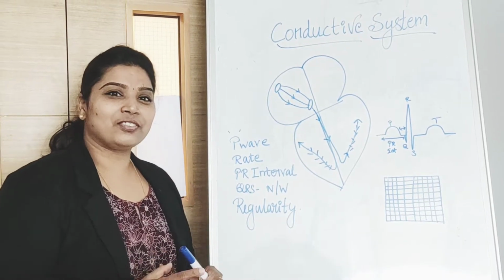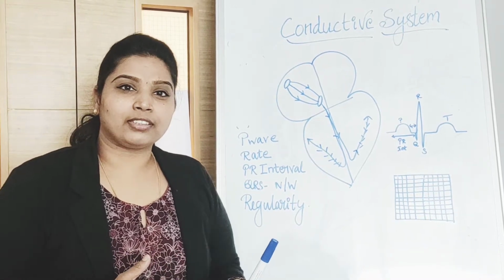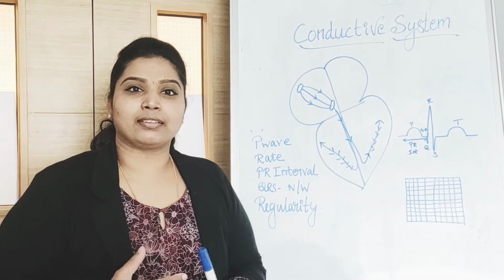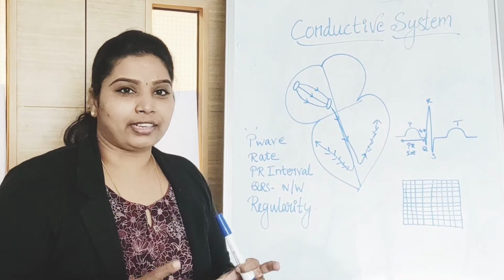Hello friends, today we will see how to identify rhythms. After identifying the rhythm only, we can accordingly plan the treatment line for the patient. So first we will see the basics of finding rhythm.